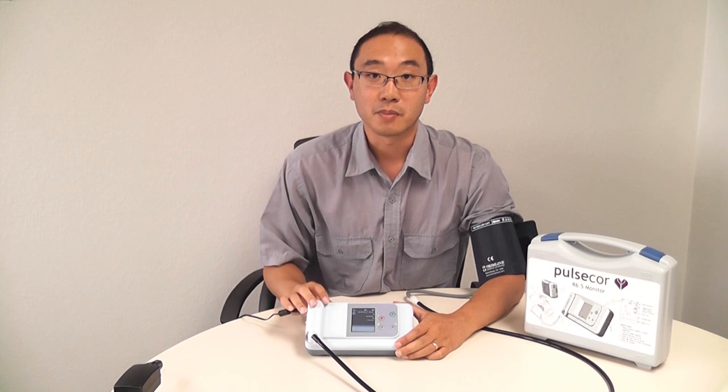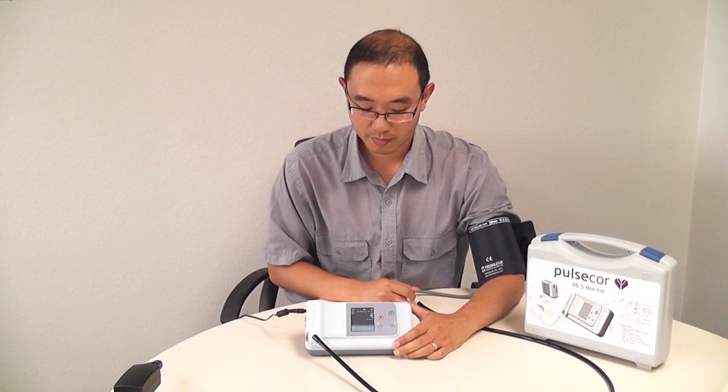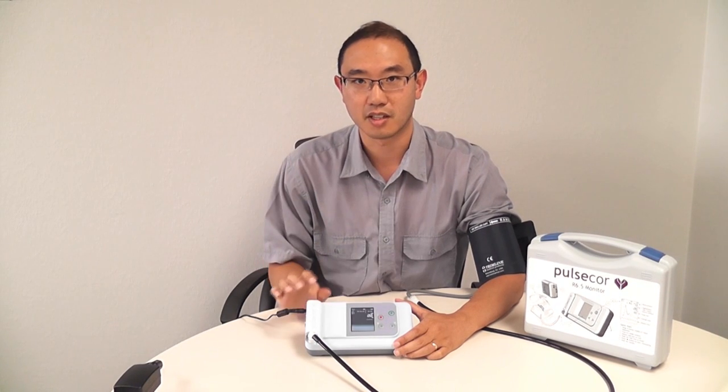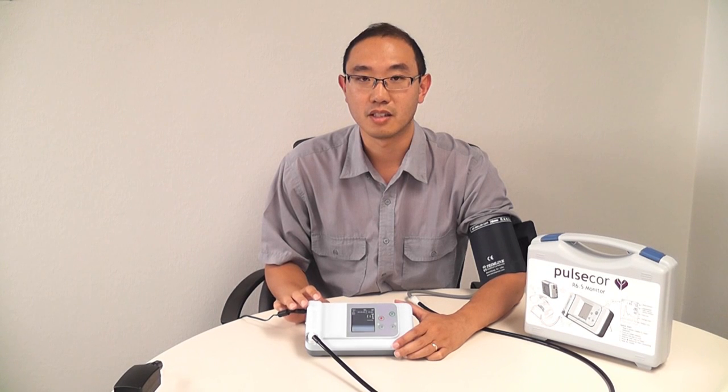Now we can take a measurement, and to do that, all we have to do is press the green button. It takes a measurement just like a normal blood pressure machine. It will inflate the cuff and then deflate.